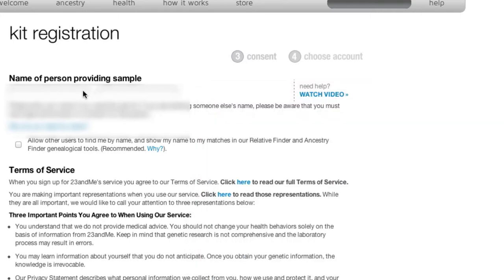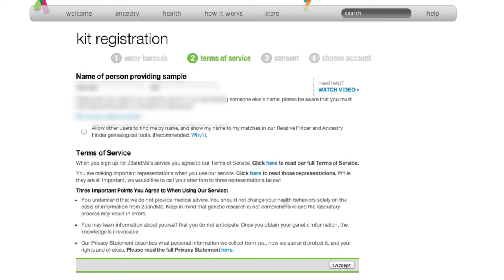Here you will enter the name of the person providing the sample — the first name first, and then the last name. Allow users to find my name and show my name to my matches in the relative finder. It's recommended, so I'm going to allow that. Make sure you read the terms of service and go ahead and accept.